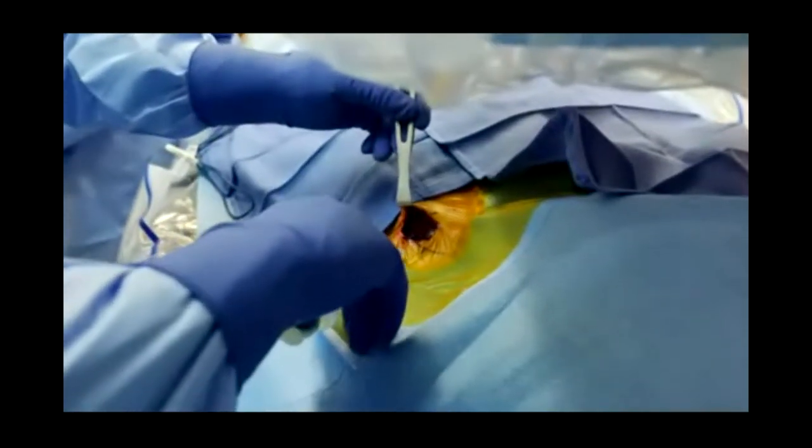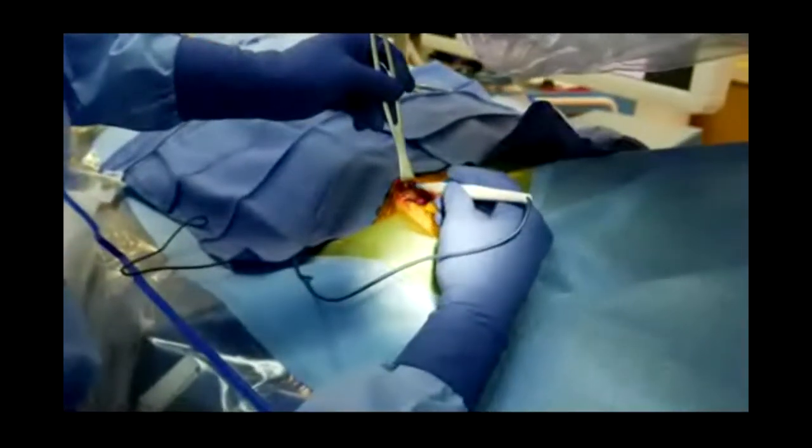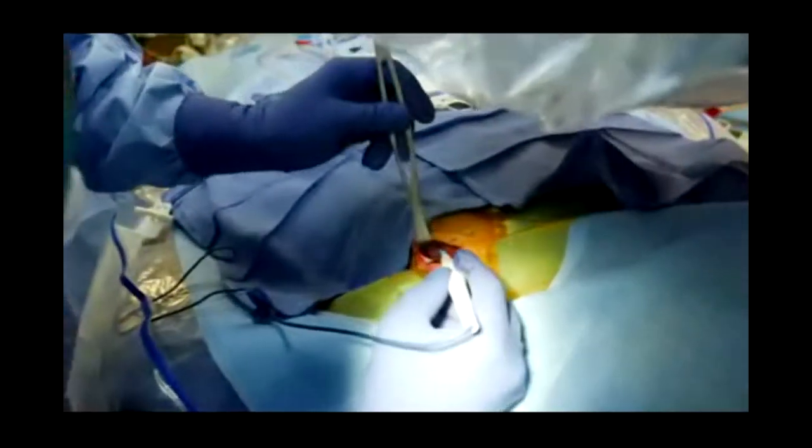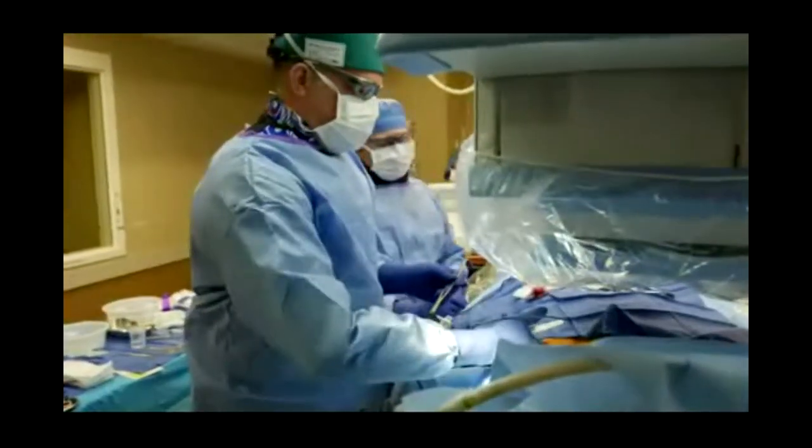So here you see us numbing below the tissue plane inferiorly, where we will create the tissue pocket with electrocautery, again staying as deep as possible right above the fascial plane, but without breaking the fascial plane. So there we are with cautery, dissecting through the skin layers, the fascial plane right below us. We have not violated that at all, and as a result we'll have minimal bleeding. Plenty of lidocaine to minimize any patient discomfort, and we want that pocket to be big enough to accommodate the ICD, which is larger than a pacemaker.